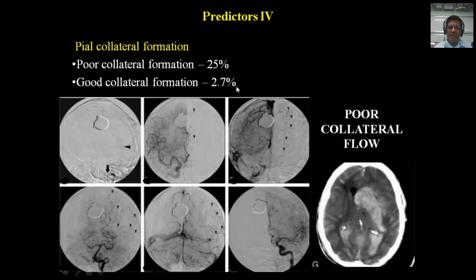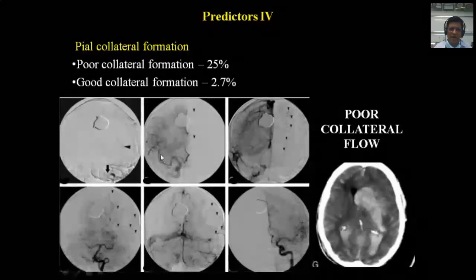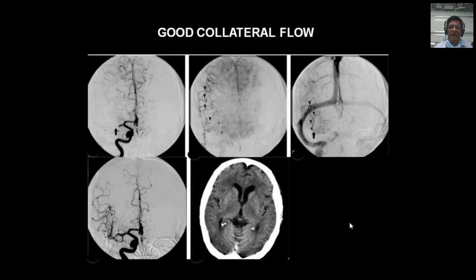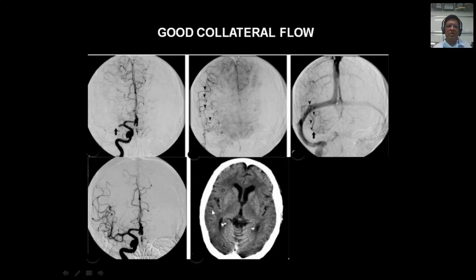Here are two examples. One patient has terminal left ICA occlusion with a massive infarct. Post-thrombectomy, the ICA opened up and both ACA and MCA are filling, but because this patient had poor collateralization, bleeding occurred in the left basal ganglia with extension into the subarachnoid space and ventricles. Compare that with a patient who had a right M1 thrombus with good collateralization on delayed DSA — post-thrombectomy CT shows no evidence of hemorrhage. Good collateral formation predicts better outcome.